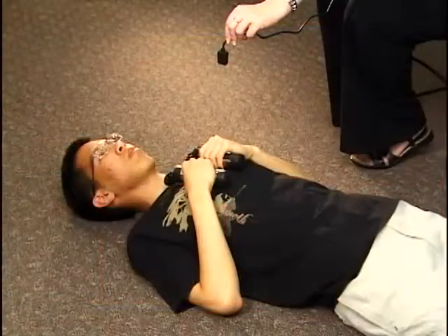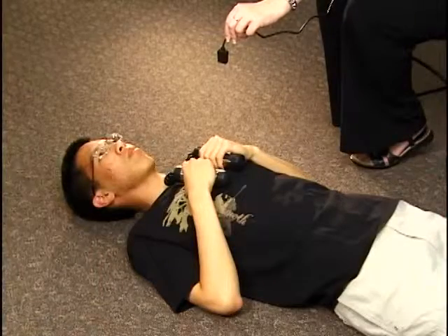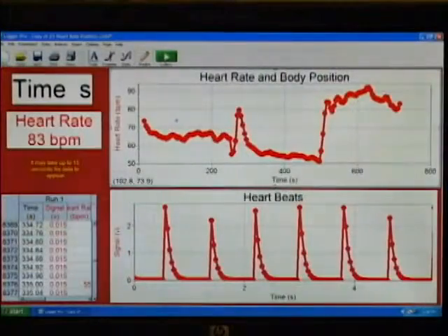Then we have the subject lie on the floor for four minutes while we record his heart rate. Now we've moved into our final body position, which is standing. We've been here about four minutes. The data collection is about to finish, and there it goes. You can clearly see the three different sections: the four minutes where he was sitting, four minutes where he was laying down, and four minutes where he was standing.